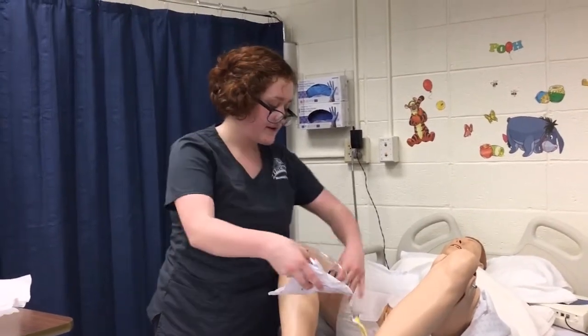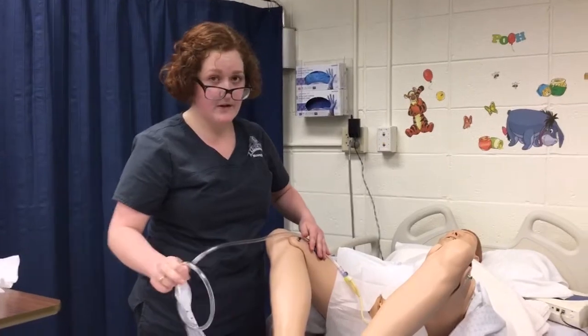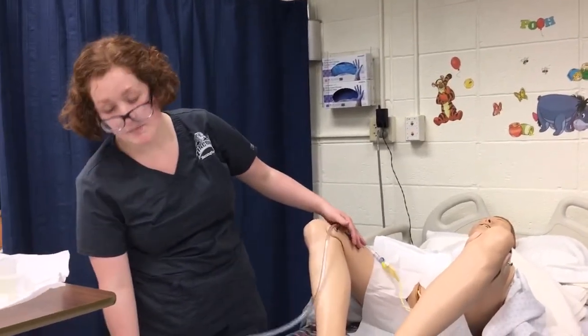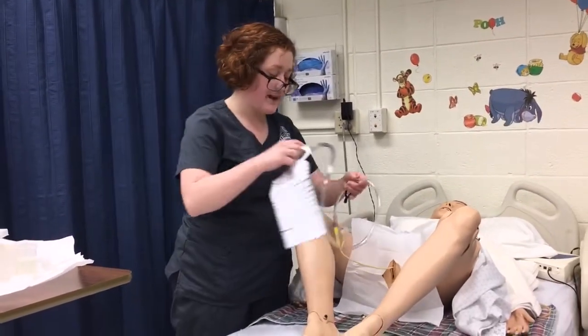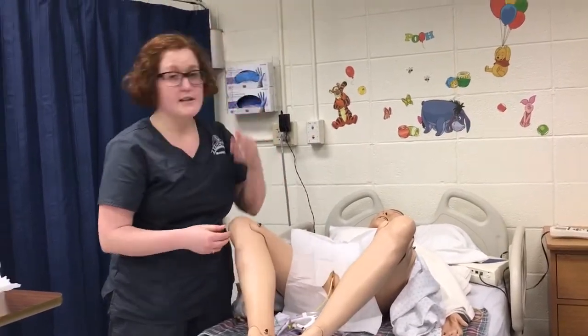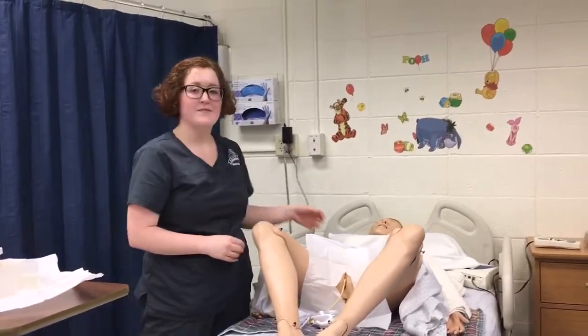With my clean gloves, I would secure this to the leg in a place where they can still comfortably ambulate. Then I would put this bag down below the height of the bladder. I would make sure that the patient is in a comfortable position. I would note any of the client's responses or discomfort during the procedure, and as always, I would document. Thank you.